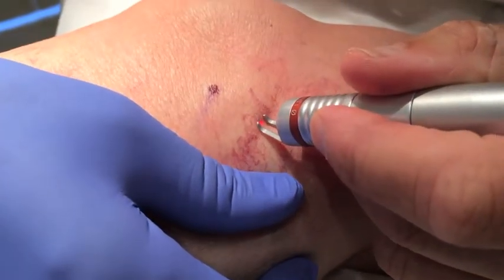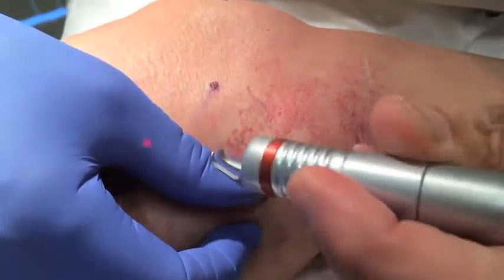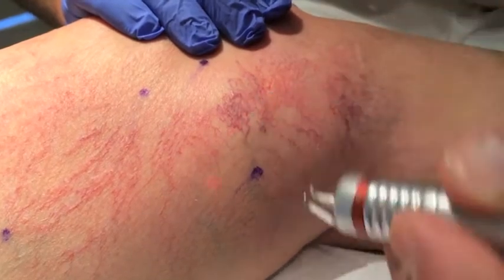This is a nice technique. Do you feel anything? Yeah. You'll see that she really feels nothing because of the subdermal.